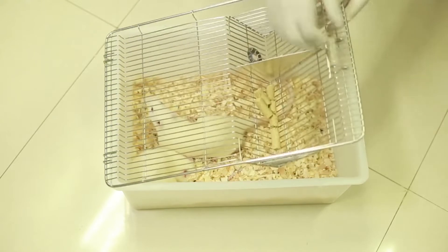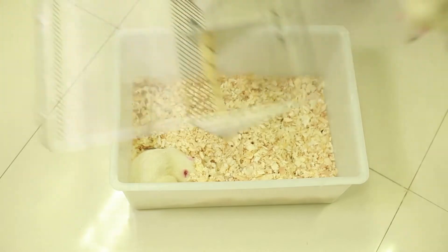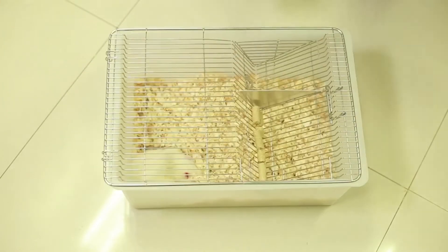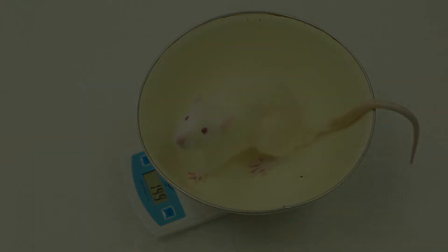House rats under standard conditions with free access to food and drinking water, kept in 530 square centimeter cages with wood shaving bedding.